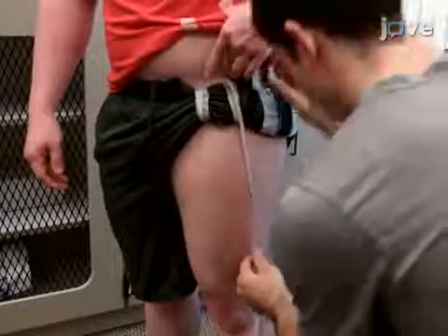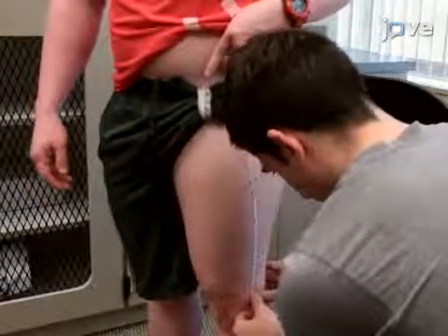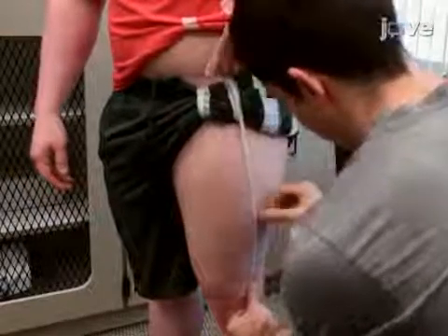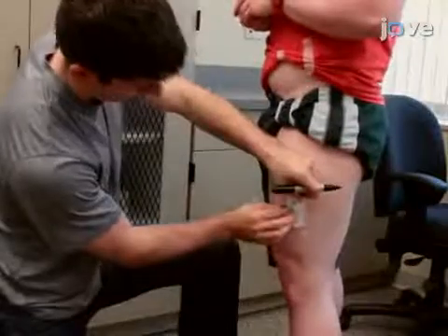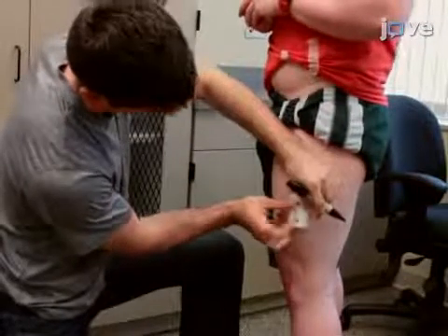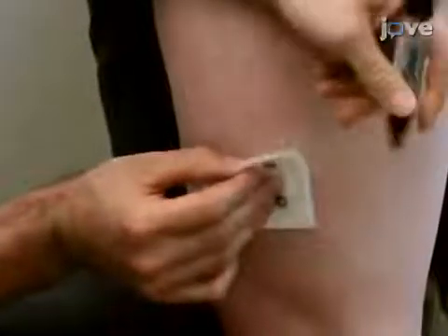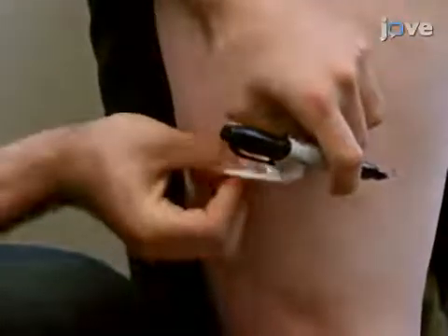Begin by preparing the participant's leg and accurately locating the vastus lateralis muscle as described in the accompanying text protocol. Then, place gel-coated silver-silver chloride electrodes over the vastus lateralis without removing the adhesive shield. Mark the location where the gel portion of the electrode makes contact with the muscle and ensure the inter-electrode distance is consistent.